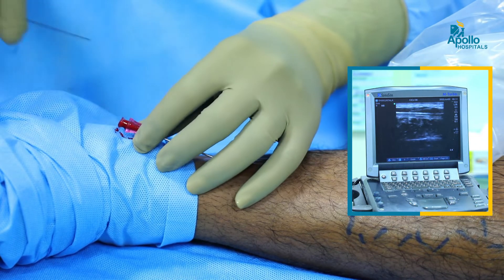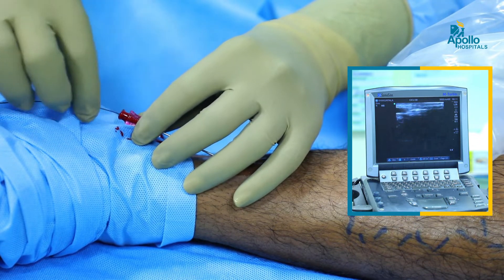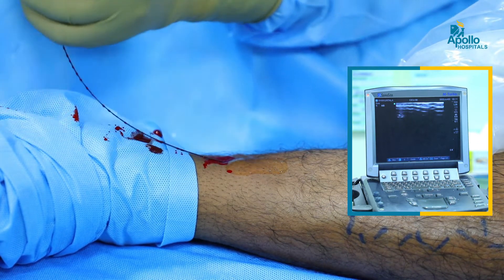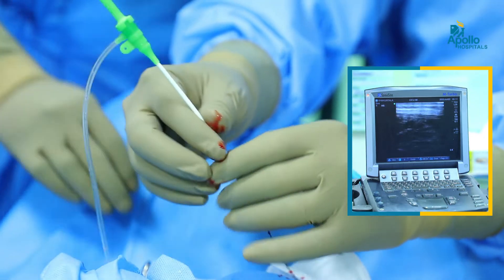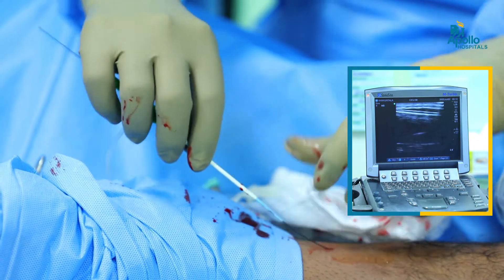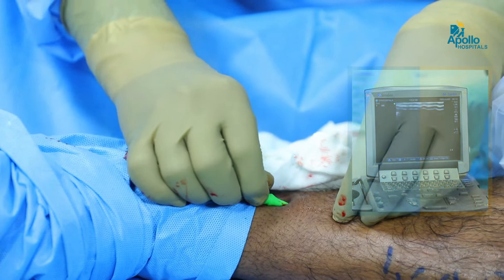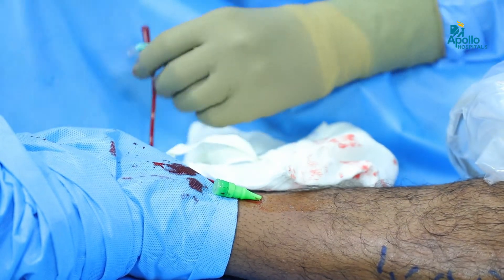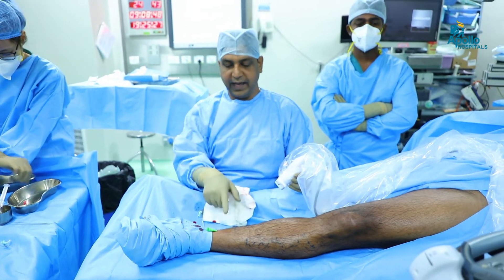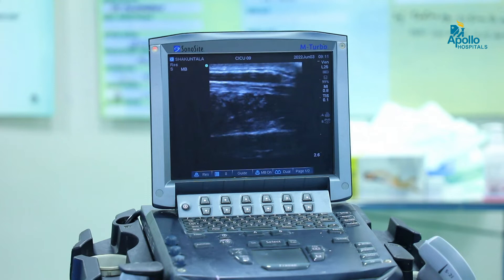So we gain access, we get back blood, and a small wire is passed over the great saphenous vein. This is a 6 French radial sheath which is passed over the guide wire. We have gained access to the great saphenous vein and we confirm that this sheath is inside the vein by ultrasound guidance.